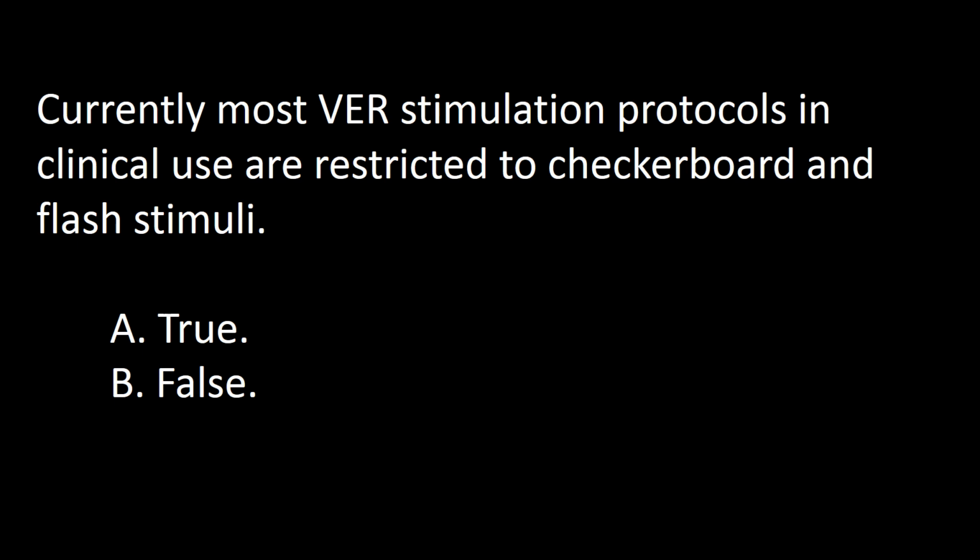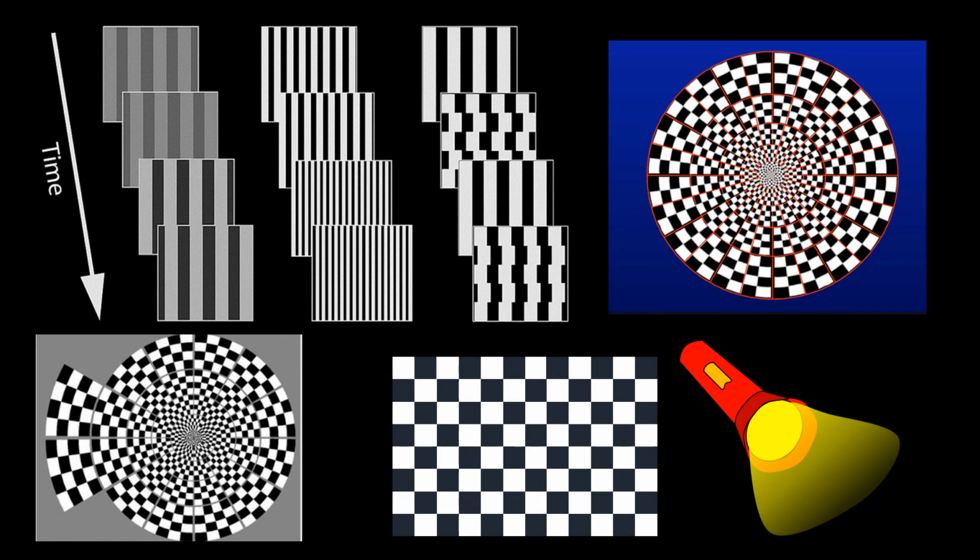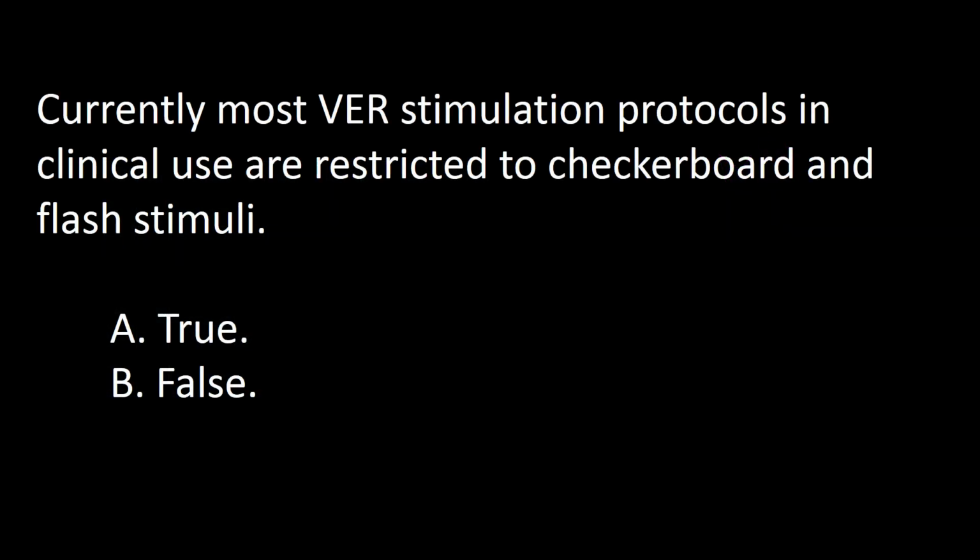Next question. Currently, most visual evoked potential stimulation protocols in clinical use are restricted to checkerboard and flash stimuli. A, true. B, false. In this frame, you find a small sample of the creativity of neurophysiologists and ophthalmologists in the pursuit of the perfect stimulus for visual evoked potentials. In this frame, you find the two that have survived: checkerboard and flash stimuli. So the answer to this question is A, true.